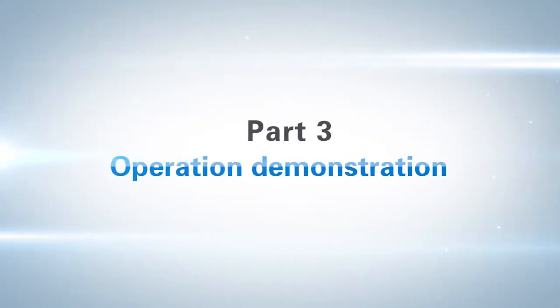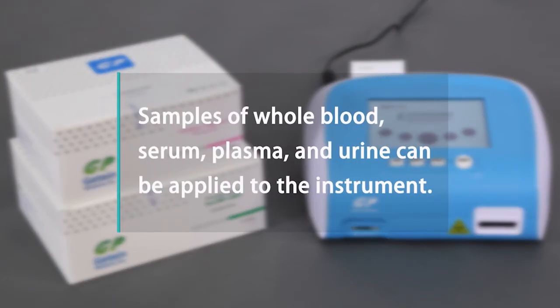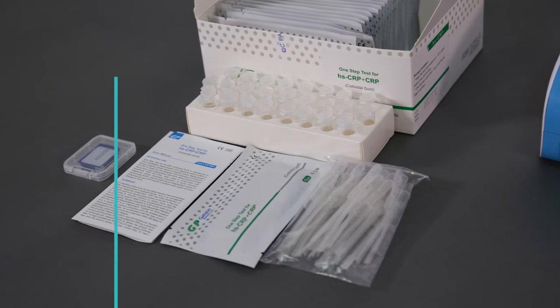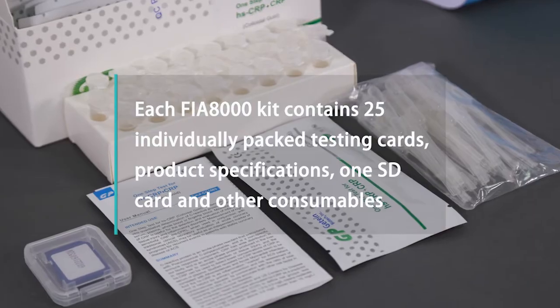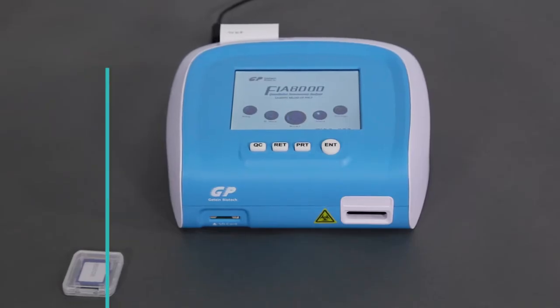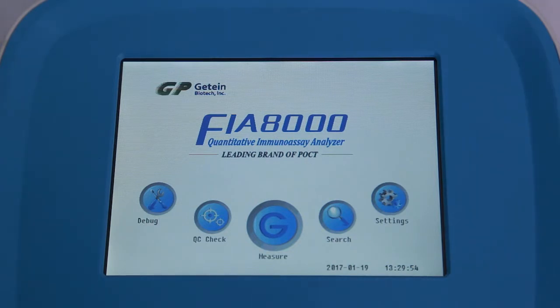Part 3: Operation Demonstration. The FIA 8000 Quantitative Immunoassay Analyzer shall be used with matched reagent kits. Samples of whole blood, serum, plasma, and urine can be applied to the instrument. To ensure the accuracy of measurements, please allow 20 minutes of warm-up time before testing. Each FIA 8000 kit contains 25 individually packed testing cards, product specifications, one SD card, and other consumables. Production dates, batch information, and expiration date are labeled on the packaging box. The test card must be used within one hour after opening. The instrument should be calibrated with a batch-matched SD card each time a new batch of kits is used.